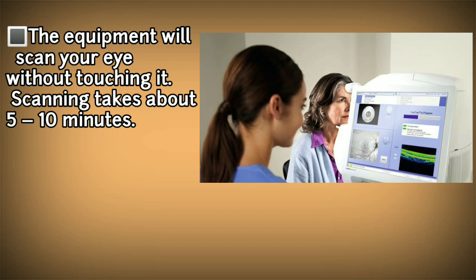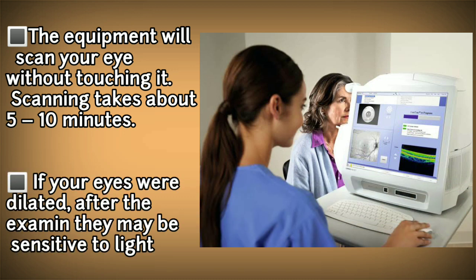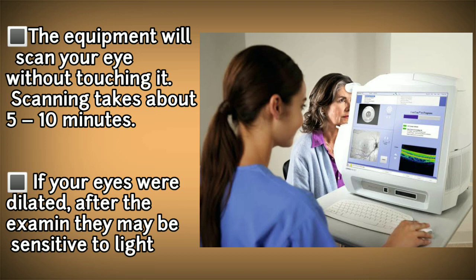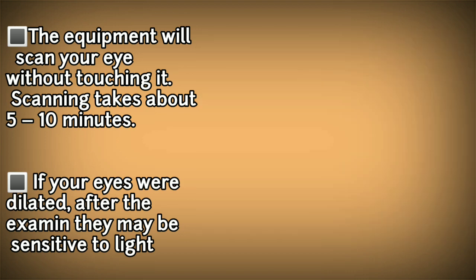The machine will scan your eye without touching. It takes 5 to 10 minutes. If your eyes were dilated after the exam, they may be sensitive to light.